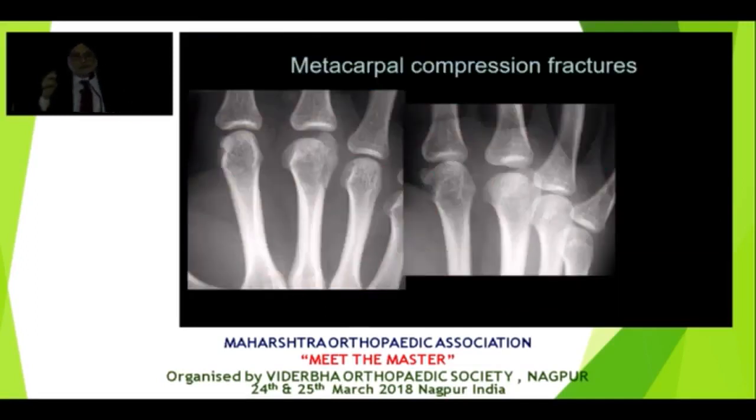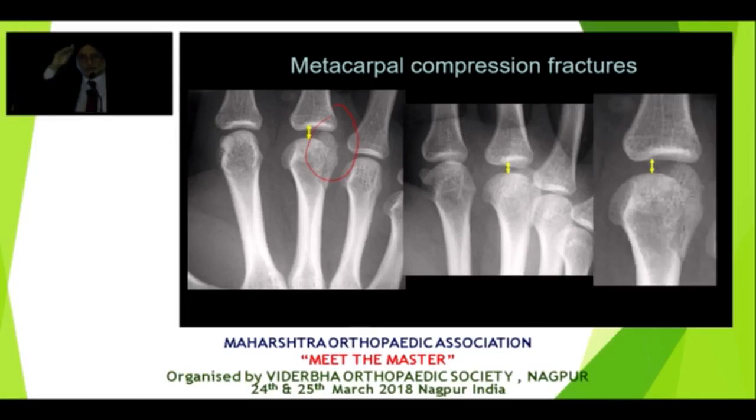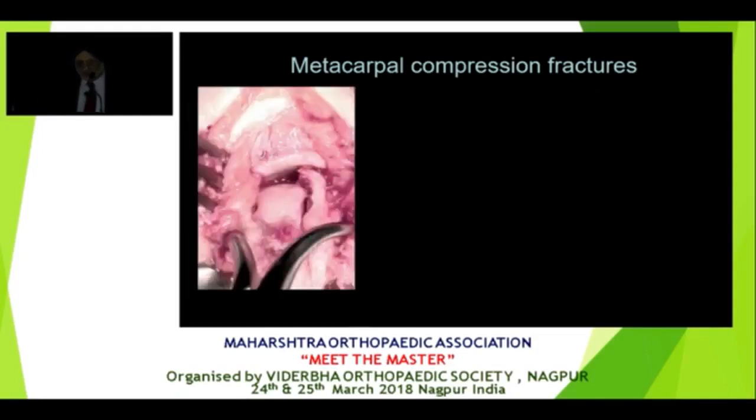Now this fracture looks a bit different, right? If you look at it, you can't understand whether this is an avulsion fragment or what's going on. But when you compare with the neighboring joints, you realize that the problem is not the fragment, the problem is the head is depressed. So this is one of the usual Friday night patients that we get, involved in a fight, punch somebody and depress the head of the metacarpal.